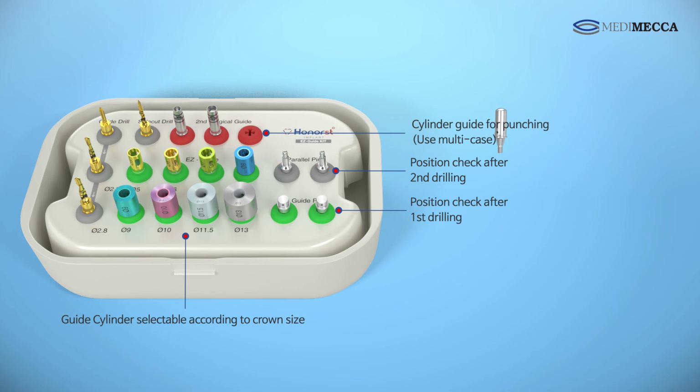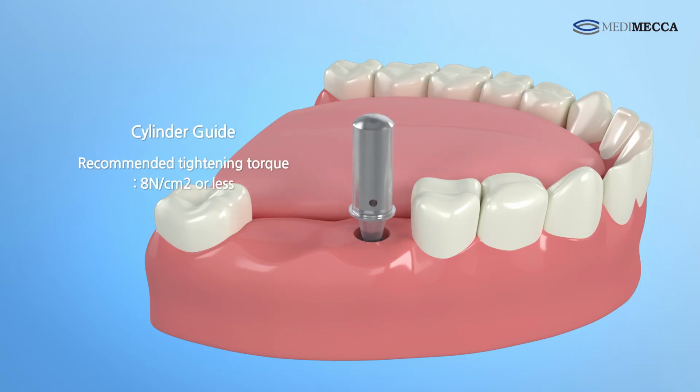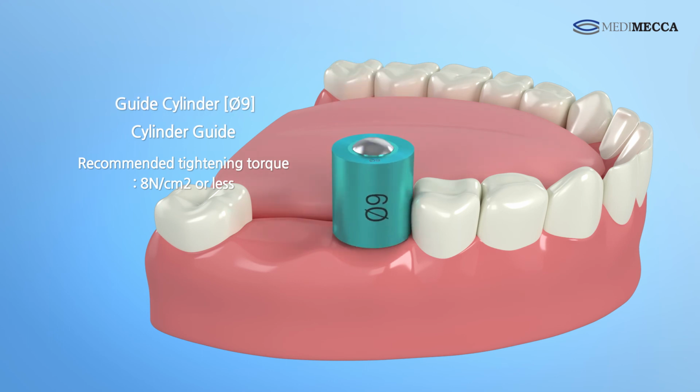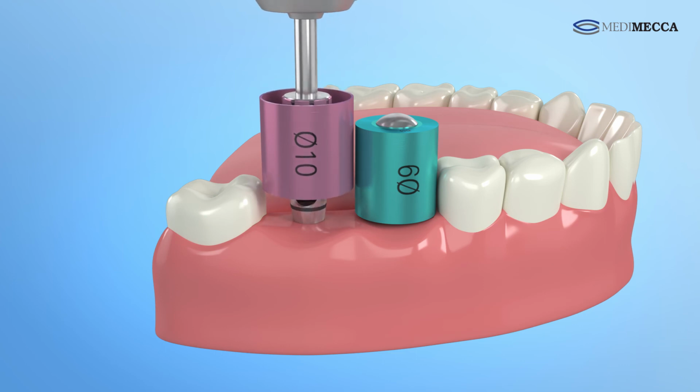When using a cylinder guide, secondary surgery without incision is possible even in multi-case. Tighten the cylinder guide. Insert the guide cylinder. Guide punching after inserting the guide cylinder.